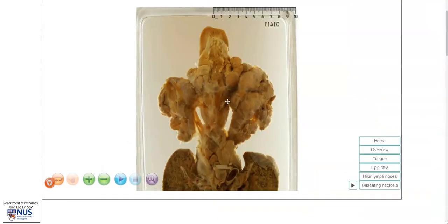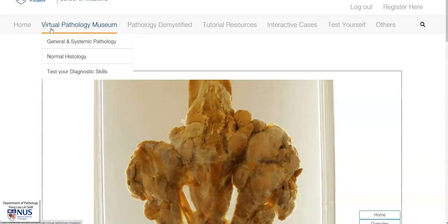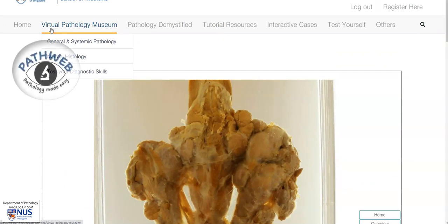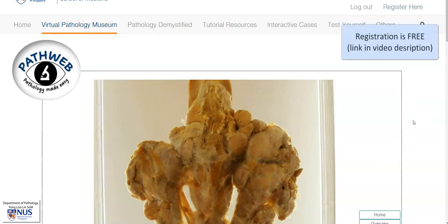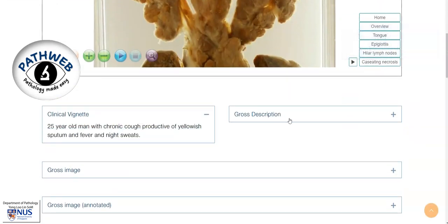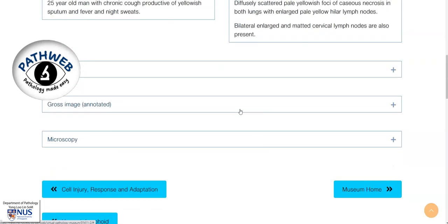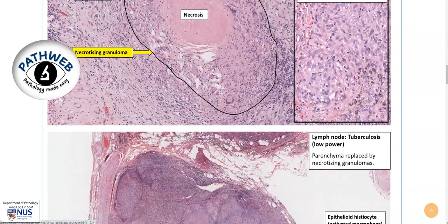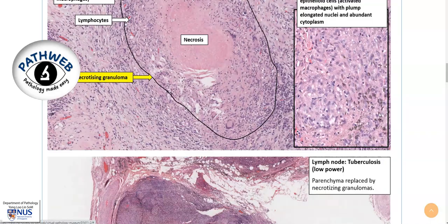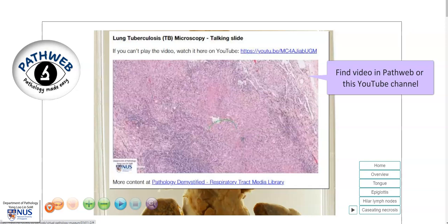Coming back to the specimen. By the way, the specimen is taken from our virtual pathology museum, and this is from our free online web resource, PathWeb — you can register for free. The link is in the video description, or you can just Google PathWeb. If you scroll down, you will be able to see more information such as clinical vignettes, gross description, gross and microscopic images, and in many of our pages you will also see accompanying videos. There is also a separate video describing the microscopic features of TB.